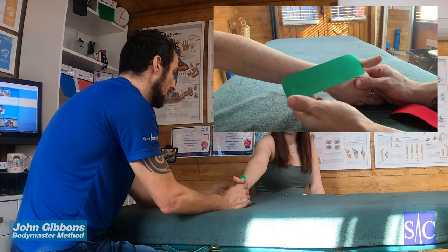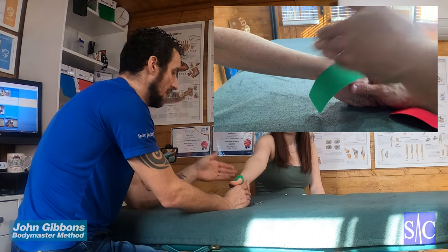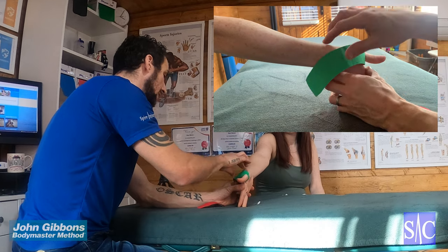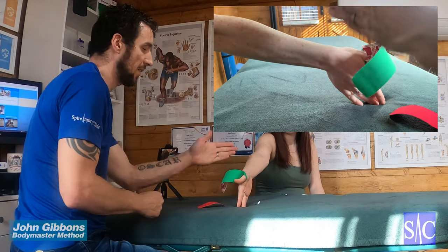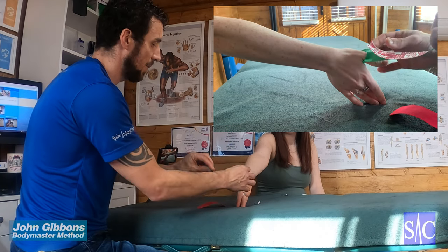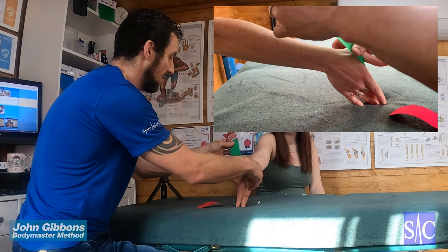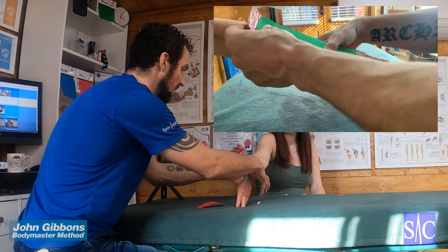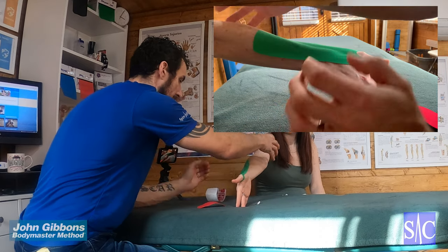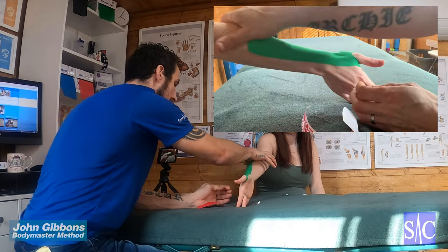From here, we're going to do a straight arm but with a bend — bending the hand down to put stretch up through this area here. So we've got a nice straight arm with a prominent bend at the wrist. Pull on the tape and the backing comes away, lift it off, hold on to the end, and then with minimal stretch follow up the side of the arm and smooth the tape over like so.